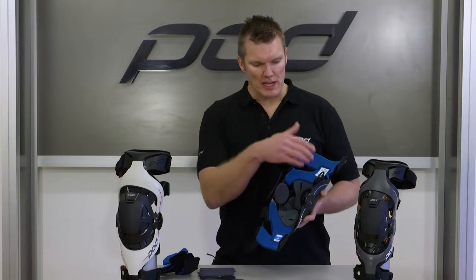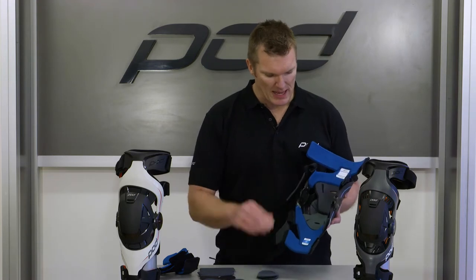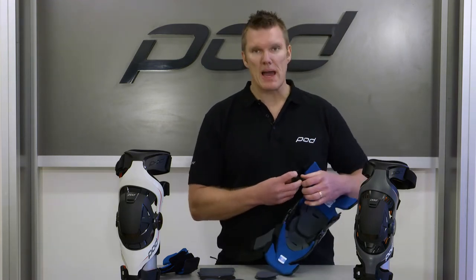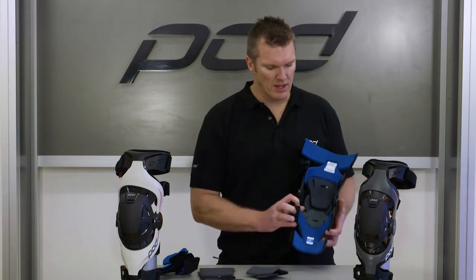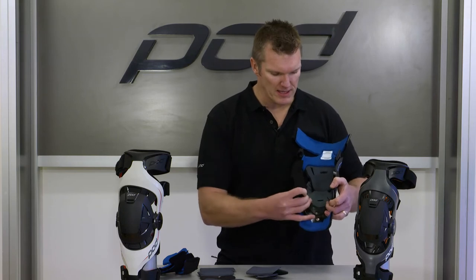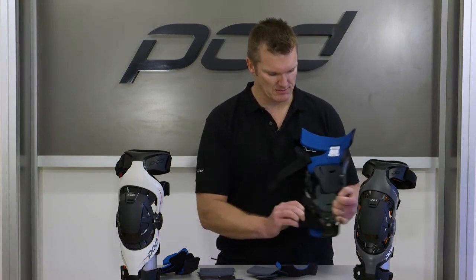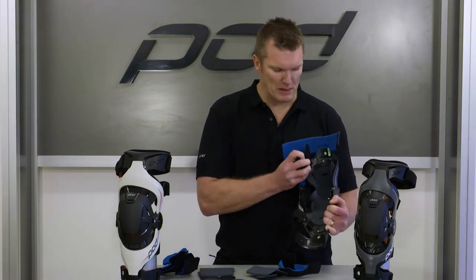Now we'll take all the padding off, starting with the knee shim pads, then the strap pads on strap 1 and strap 2 — we simply peel those off. At the bottom of the brace, take off these frame pads. There are actually two pads down there. And then the upper frame — same thing — there are two pads there as well.